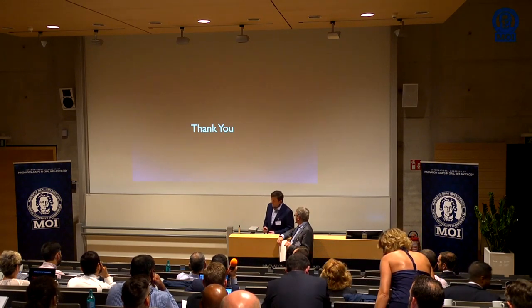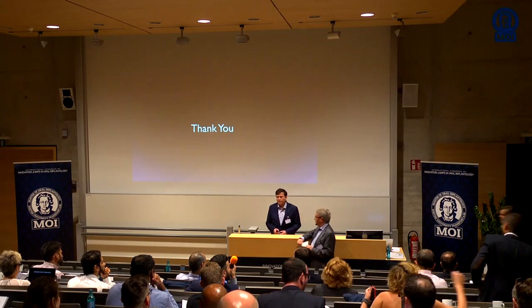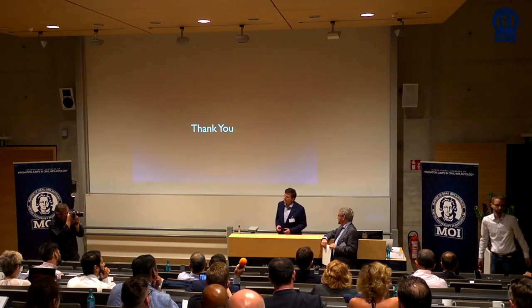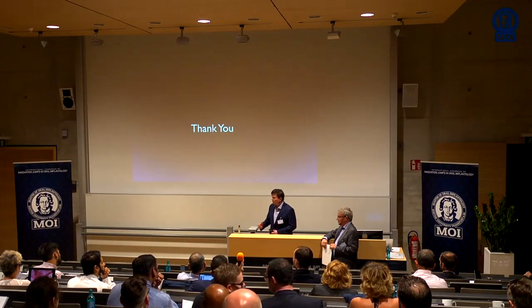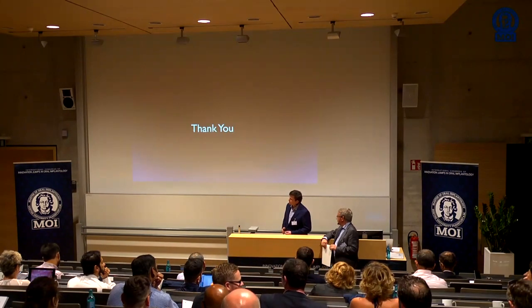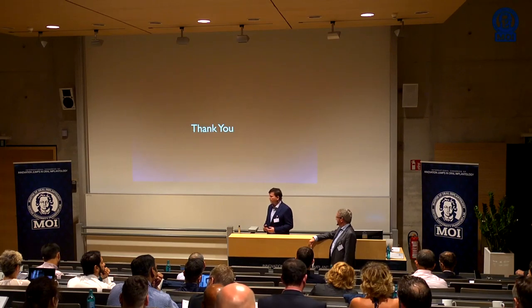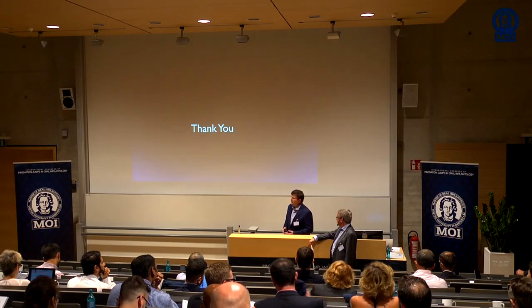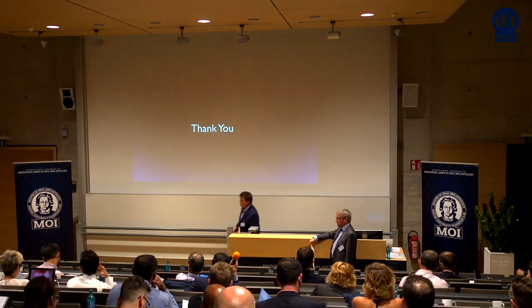That's a very good question. And the answer is yes, I have had complications. I have had PMMA fracture. Luckily the fractures have been lucky breaks, in the small short cantilevers that I've had, and they're very repairable. The final restoration that you saw, the gentleman on the right side, his broke. I built up a bit of composite in the back just for smoothness, and then we carried on. In the lab, based on the records that we had from the beginning, the lab was able to deliver the zirconia restoration at the end.